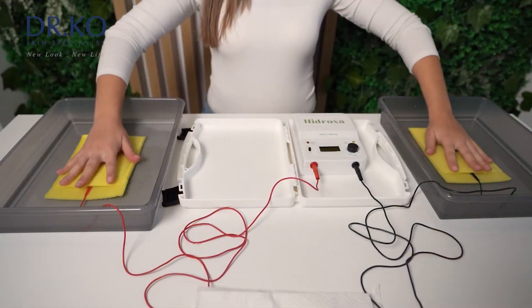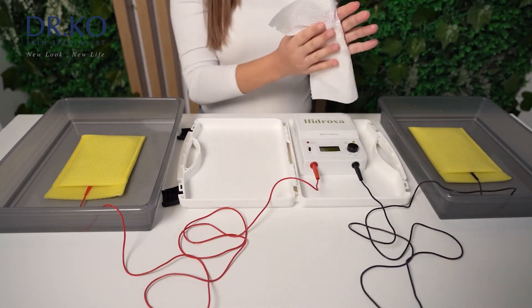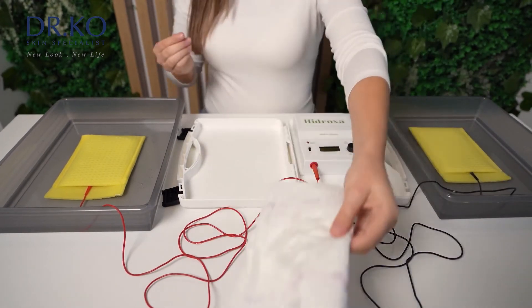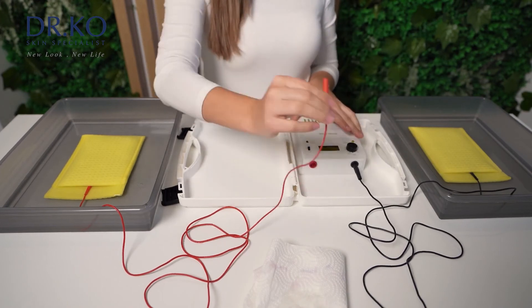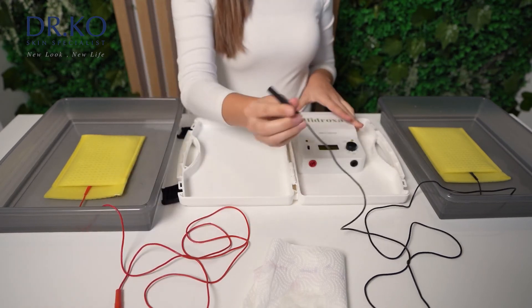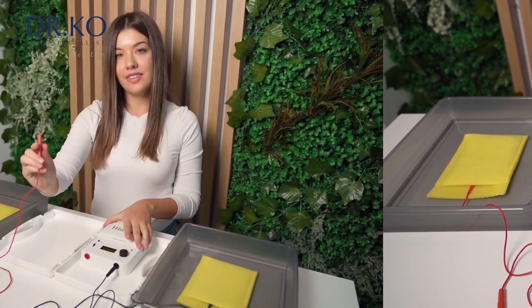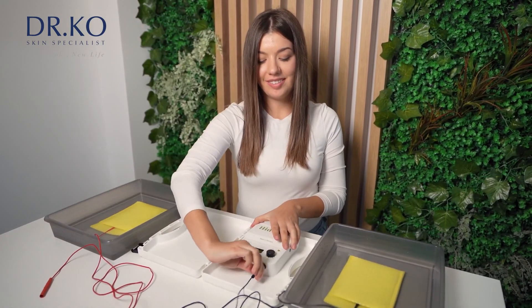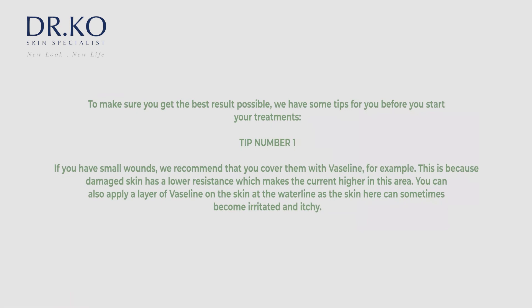After finishing the treatment, switch the device off, remove the electrodes from the water and remove the red and black cable from the electrodes. Empty the plastic containers and wash the electrode pockets in lukewarm water. Leave the electrodes in the pockets while washing them, because they can sometimes be a little tricky to put back in place again. Then put them aside to dry. You can leave the cables in the electrodes to avoid electrodes being worn out.